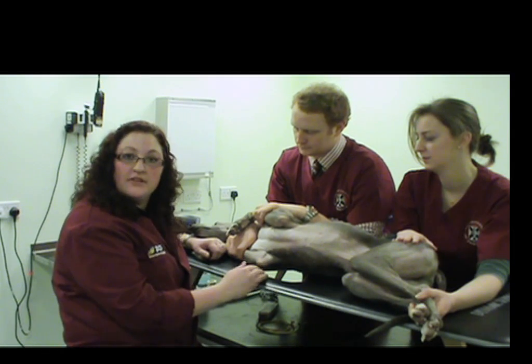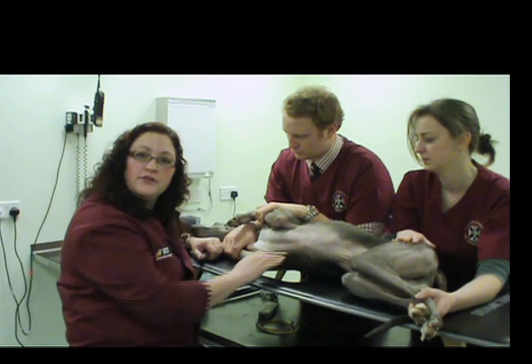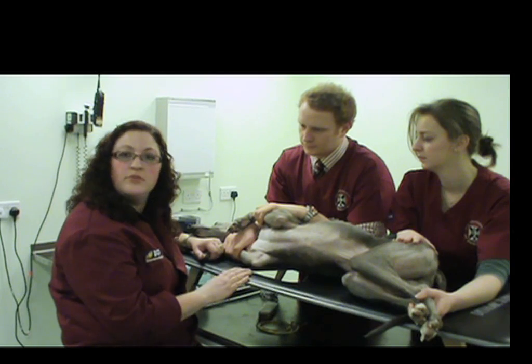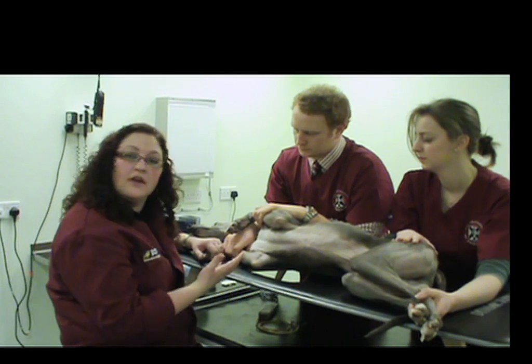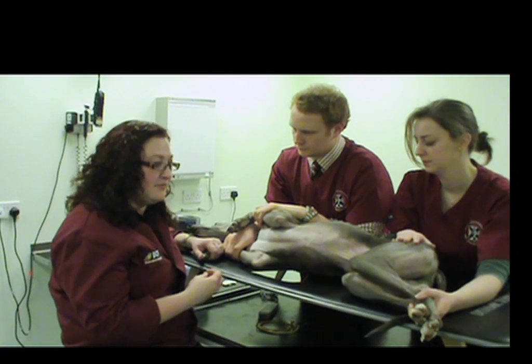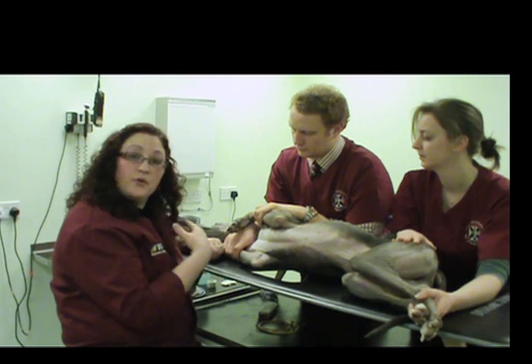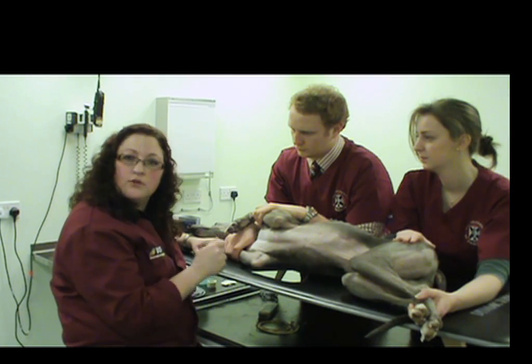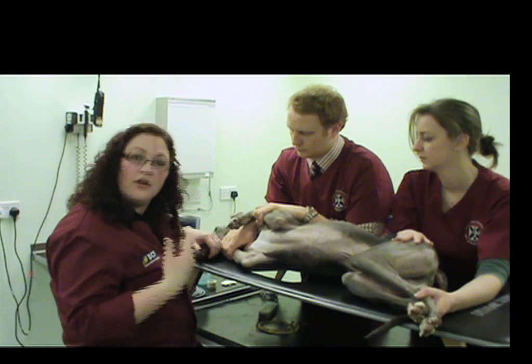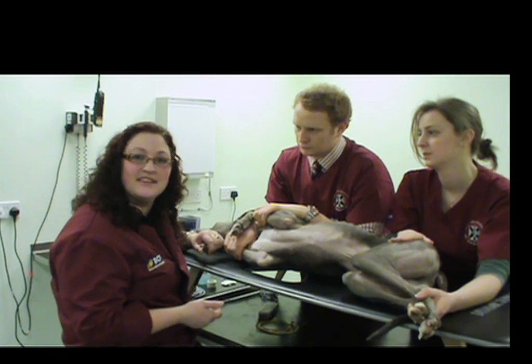Now we will look at the equipment required to start performing an ECHO exam. There are a few different things to consider, and the first and most important is the patient and patient comfort. Part of this includes the selection of the location where you'll be performing your ultrasound exam. One of the best things you can do to get good quality images and the most diagnostic information is to choose somewhere that's a little bit out of the way, not in the main thoroughfare, and hopefully a bit quieter — which can be difficult to find in the general practice setting.